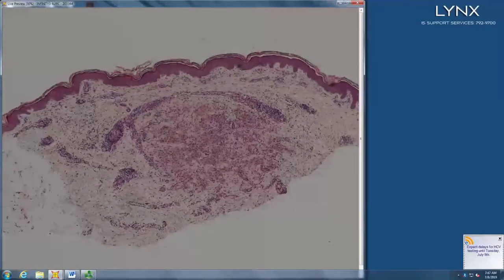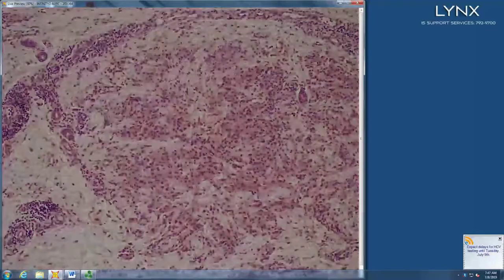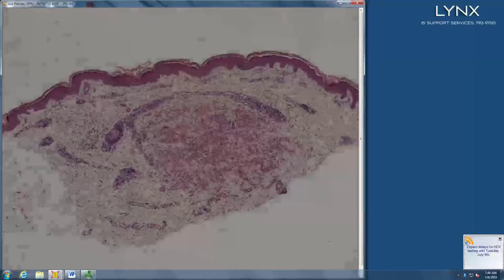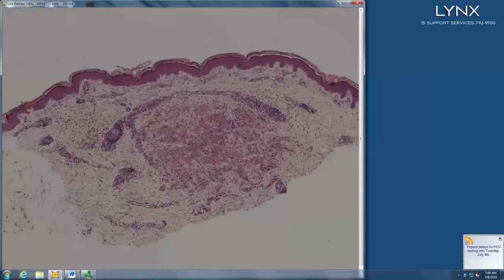I can't tell if it's proliferation or inflammation, but you also have some superficial perivascular lymphocytes. Does this displace collagen or wrap around collagen? It wraps around. Is that more likely a tumor or an inflammatory infiltrate? Inflammatory. It looks granulomatous. Is it top to bottom, side to side, or focal? Focal. What would be focal, interstitial, granulomatous? GA. Interstitial GA.